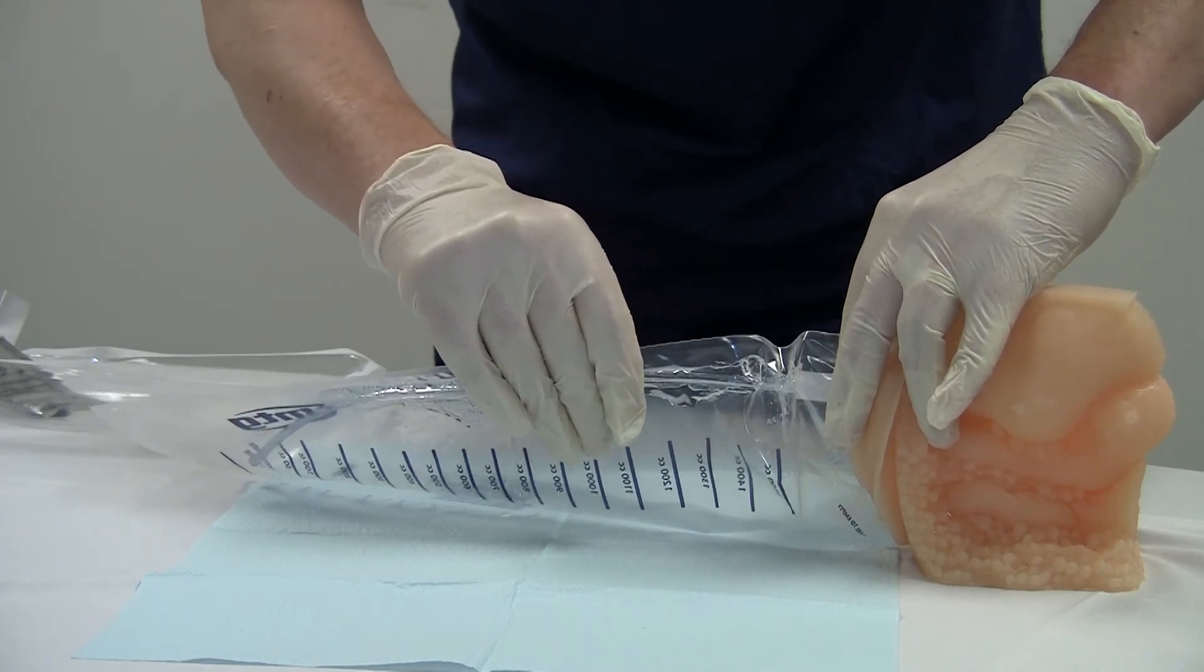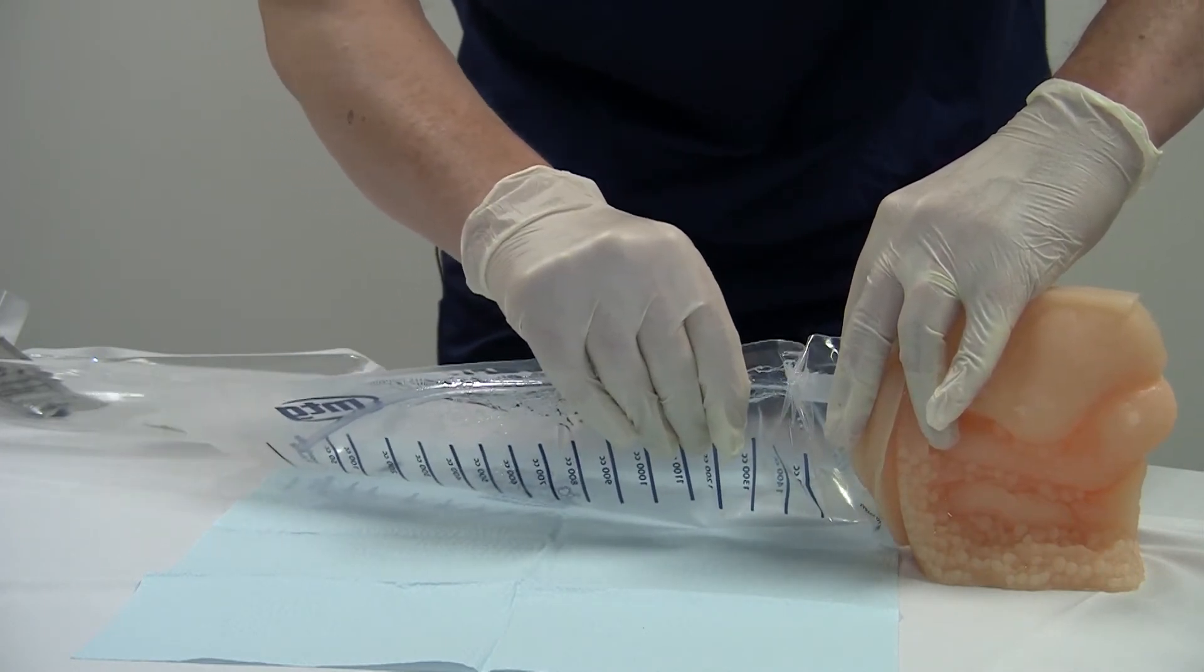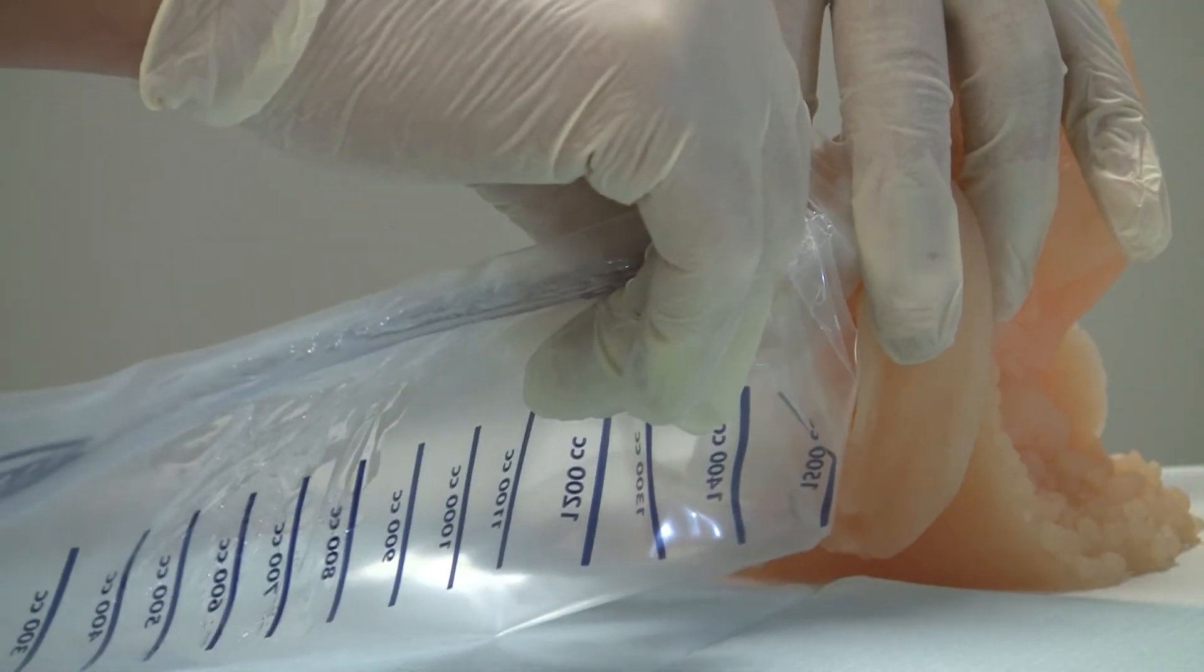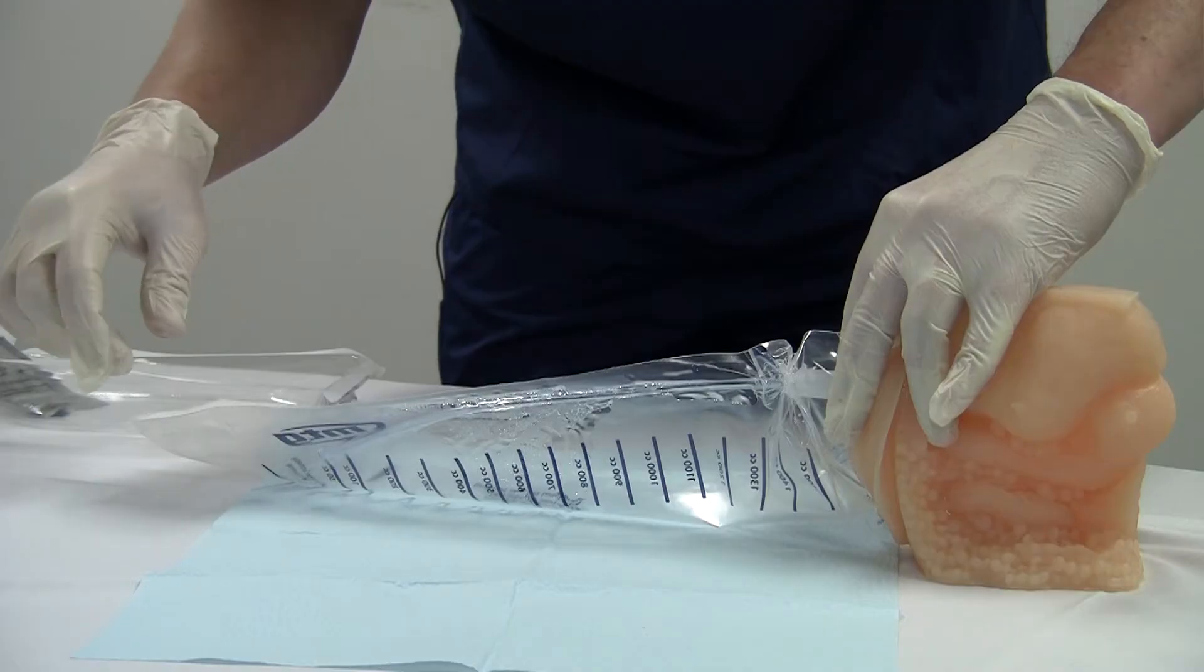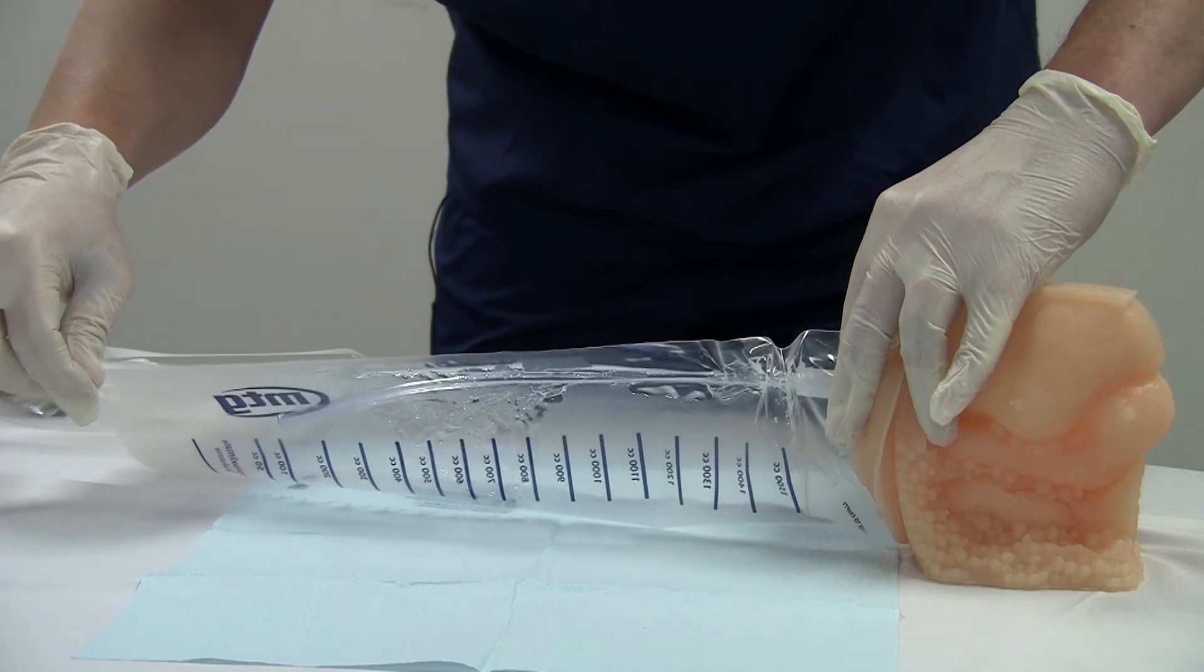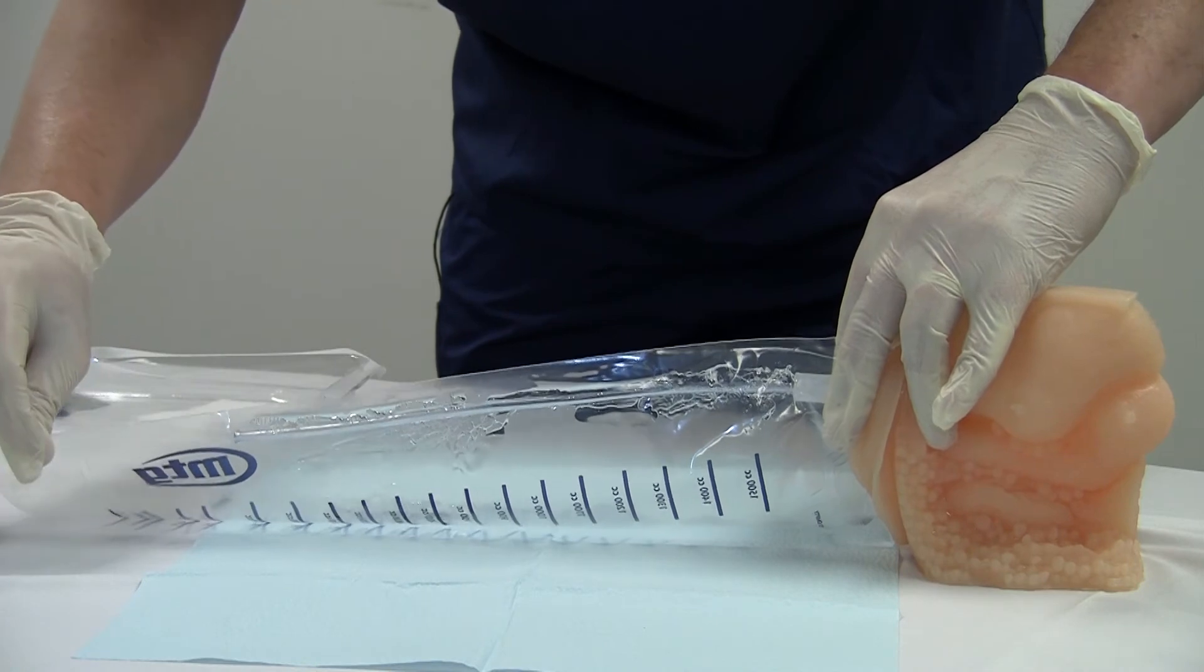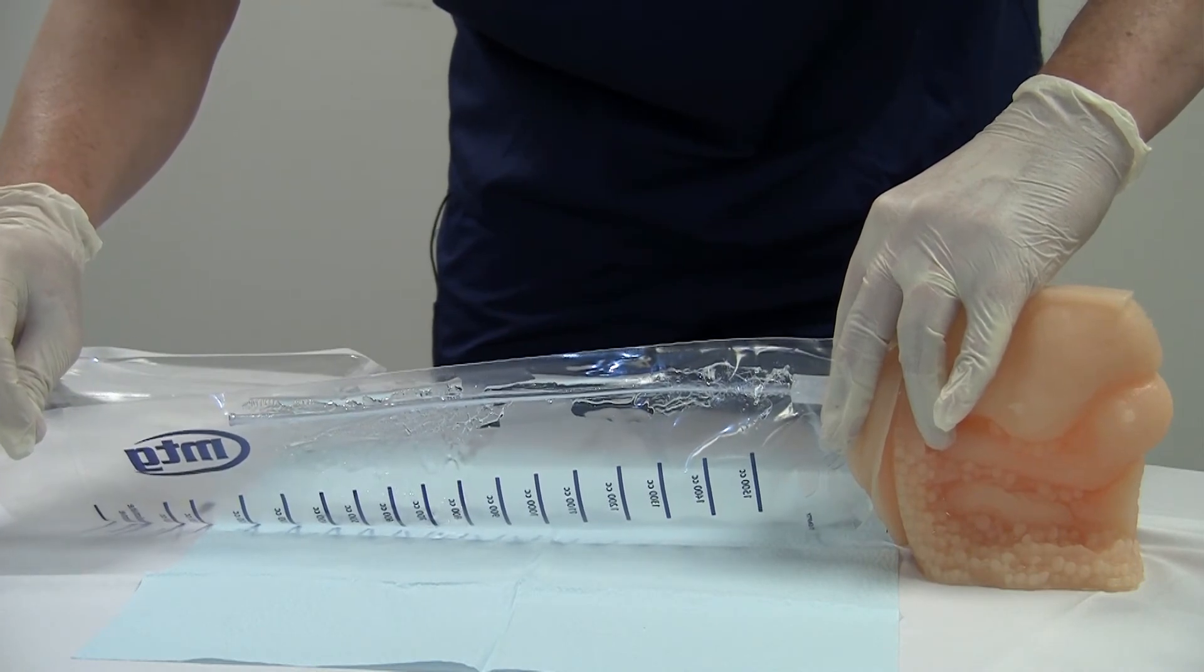With the female, you only have to put it in about two pushes before the catheter reaches the bladder, and then one more push once we see urine to get the catheter right in the middle of the bladder. Straighten the bag out, position the bag between the patient's legs just like so, and the urine will pool down here at the bottom of the bag.